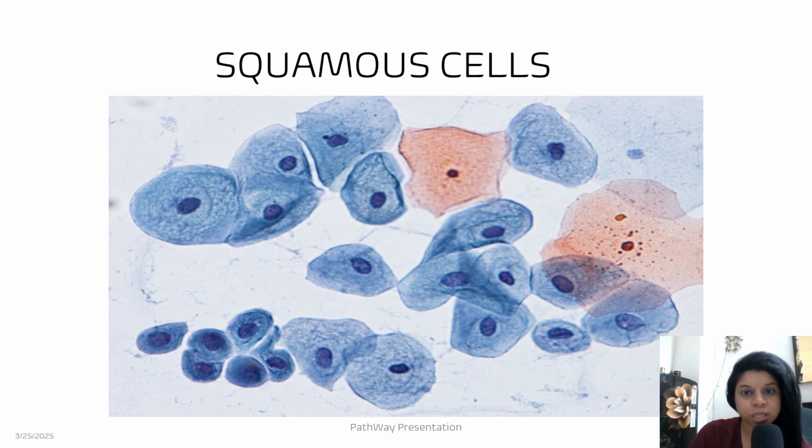And now you can see this is a group of squamous cells. Basal cells I didn't mention, because basal is like the parabasal cell only with a higher NC ratio. So you can see these cells are basal cells which have a higher NC ratio. The cytoplasm is much less and the nucleus is much higher. And these are the parabasal cells. You can see the cup and saucer.